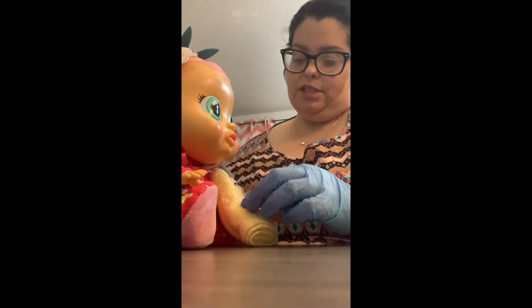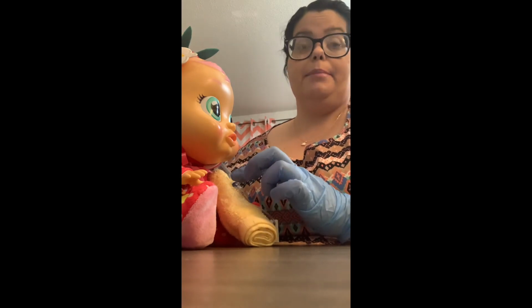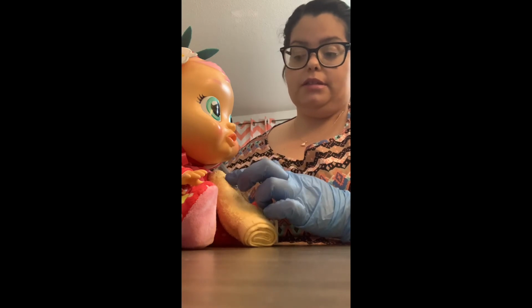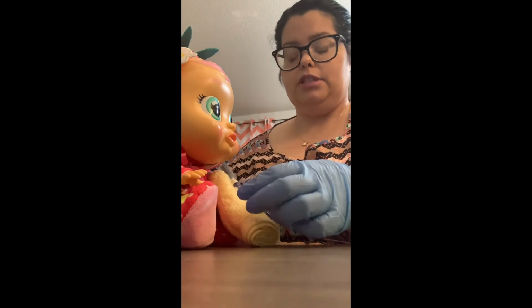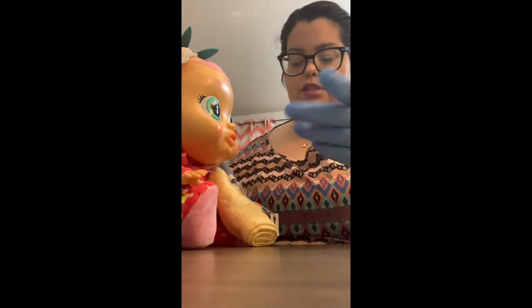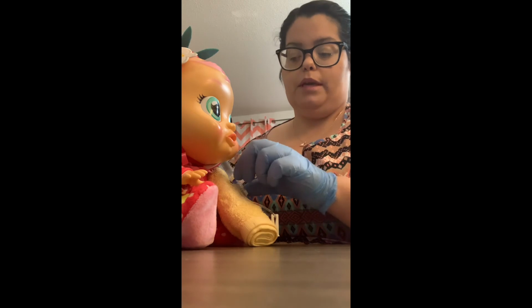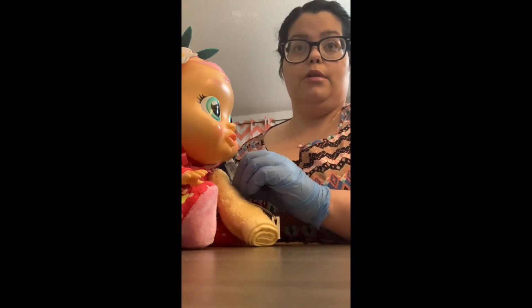So we are flushing the IV. We're asking her to see if there's any pain or any discomfort with the flush. It looks good. It looks like no infiltration or any infection occurring. Once we have flushed the IV and we make sure that it is running and it's patent, we will now disconnect and connect our medication.